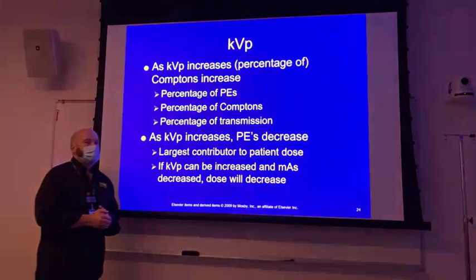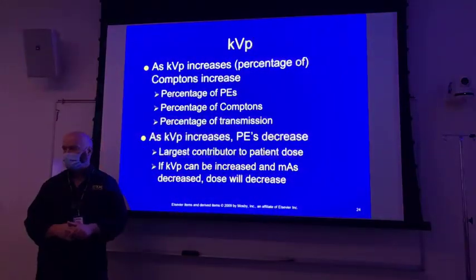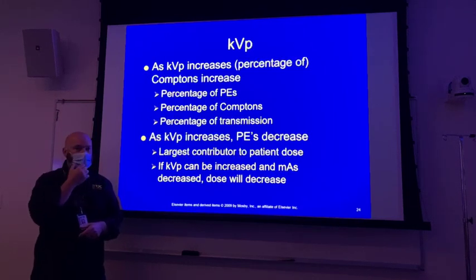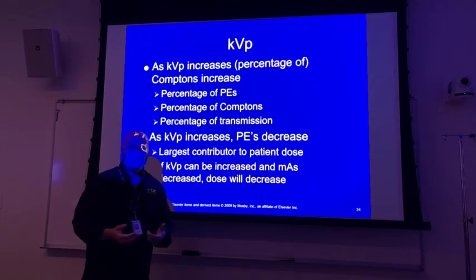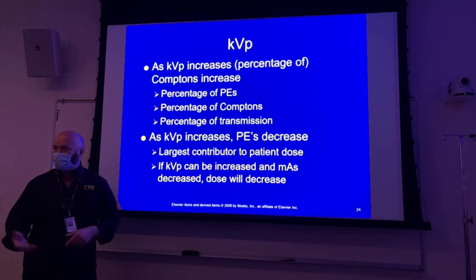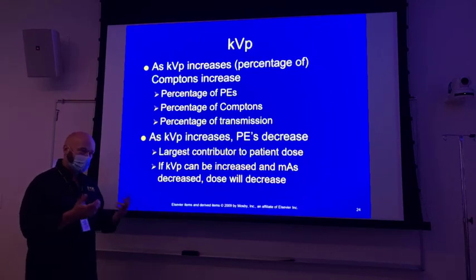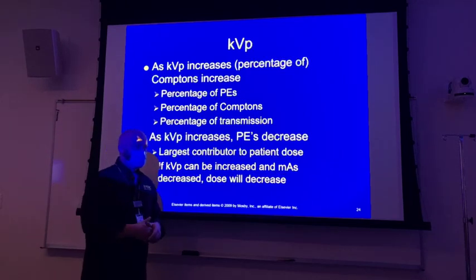So, you're shooting portable chest x-rays. What kind of techniques, kVp, are you using on portable chest? Anybody using 100 kVp? I've worked in hospitals, kind of played with that, and on film it just made a great mess. But 100, 110 kVp on a portable chest X-ray, you're going to create a whole lot more scatter radiation than using 80, 90 kVp. Yeah. So you create more scatter radiation.